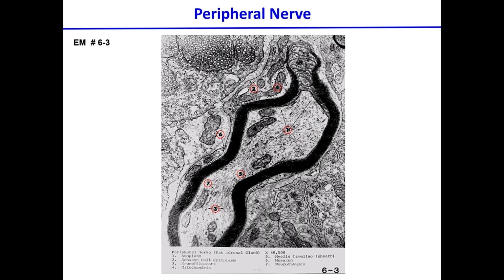Can anyone guess the kind of cell that we have in here with this heavy stain? Could it be myelin? Dark staining structures, very thick, the structures in there. So the axoplasm, these arrows point to the inside of the cell.